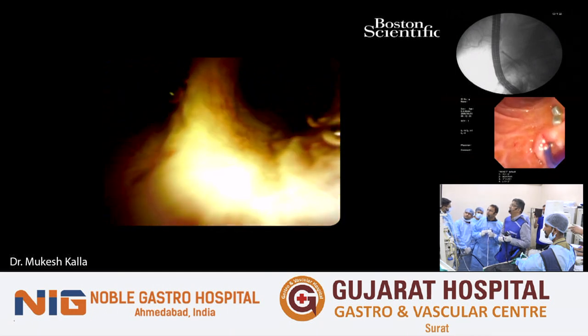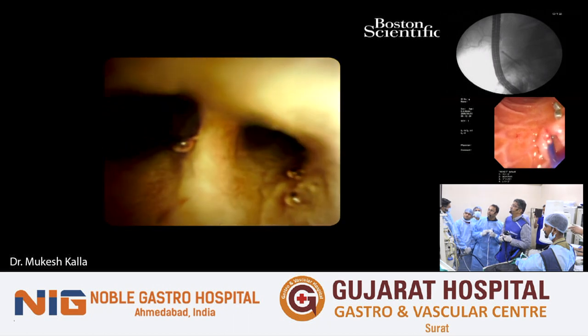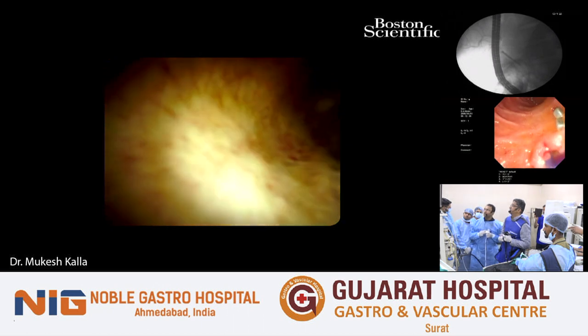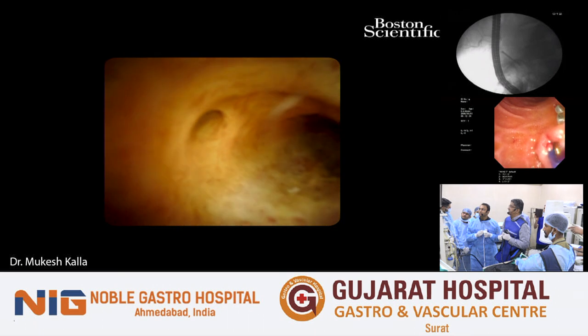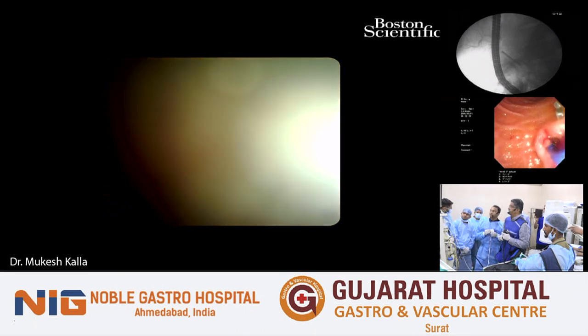I don't think this is the cystic duct. This is a bifurcation towards the right side. I think maybe anterior and posterior. We want to go this side? Yeah, let's see. Oh, we can have a proper visualization. Probably the patient had a stent inside, so some amount of erythema is because of that stent.